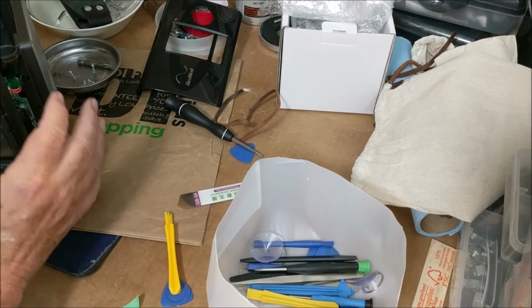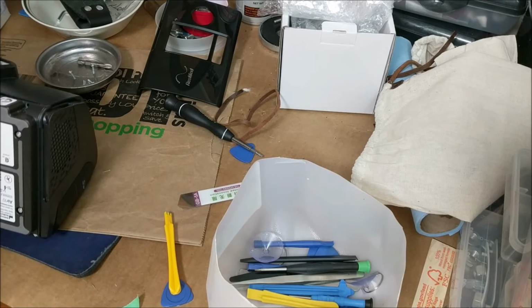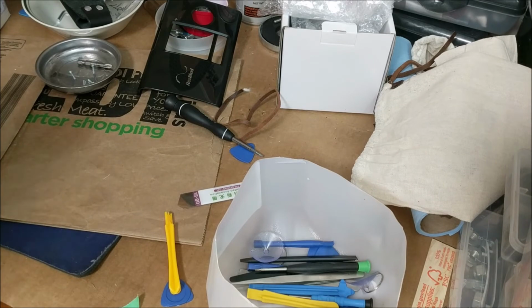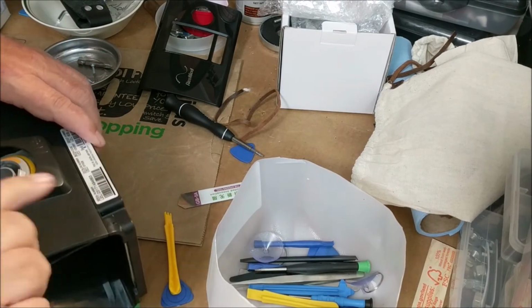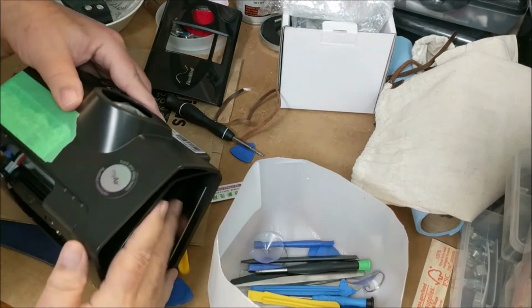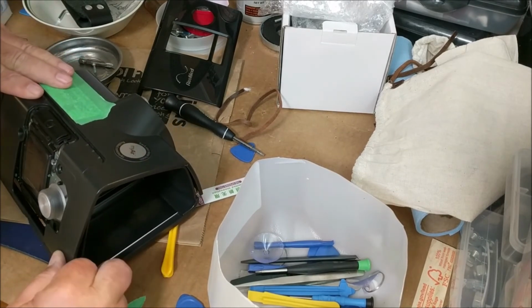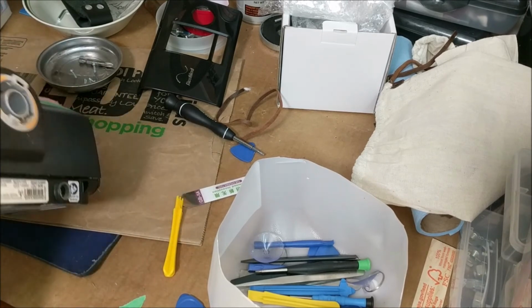It doesn't say how he did it as far as putting it back together. Let's see. We're supposed to take the front off first, so let's put the back on first. And it's got these little things that go straight down. So we'll put that in. Pull out on this. Push in, there it snaps.